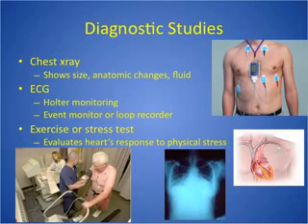So oftentimes I see a question asked where it'll say the patient has fatigue and increased heart rate and blood pressure. Do we need to stop the test? The answer would be no, you don't stop the test, because that's what we expect to happen. So then when do they stop the test? Usually it's if the ECG is showing hypoxia to the heart muscle or dysrhythmias that they would decide to stop that test. So just make sure you keep that in mind.